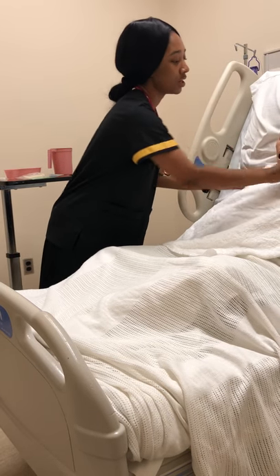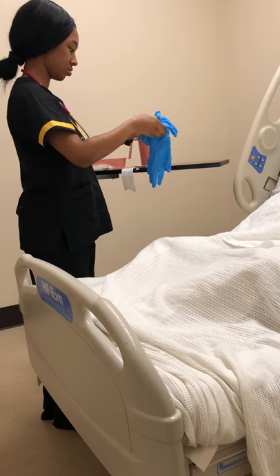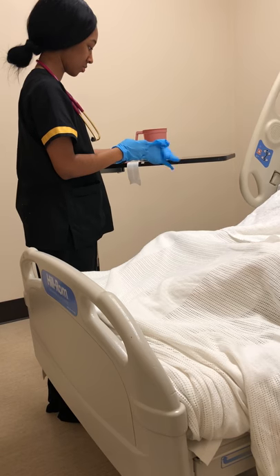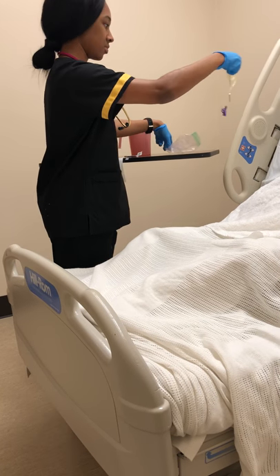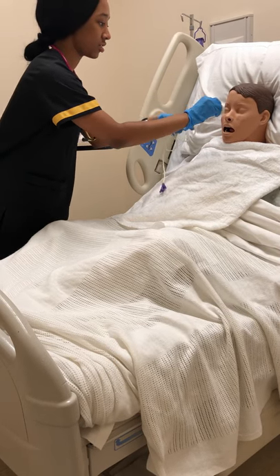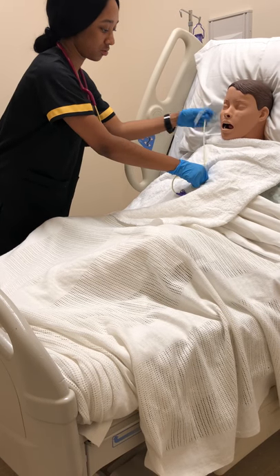I'm just going to place this towel on you just in case if you spit or gag or anything, it can just land on that towel. All right, and then I'm just going to get started. My tape is already torn and measured. So first I'm just going to measure the tube starting at your nose down to your earlobe and into your xiphoid process. I'm just going to lay that there.